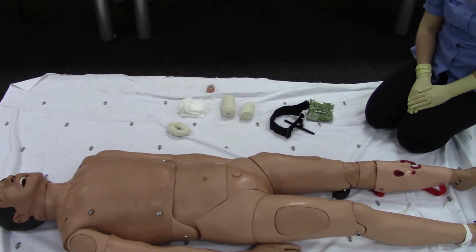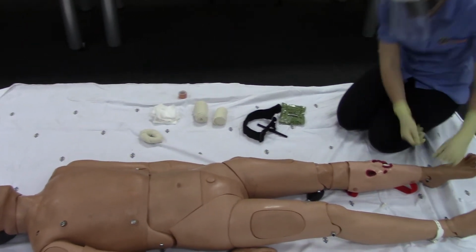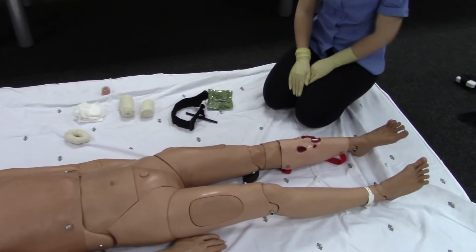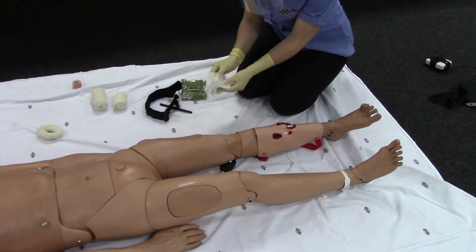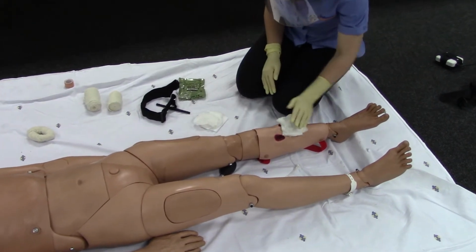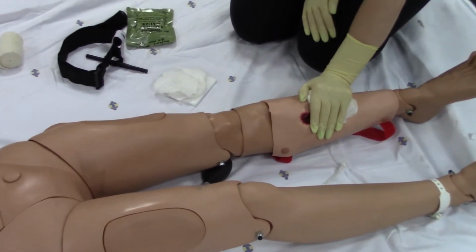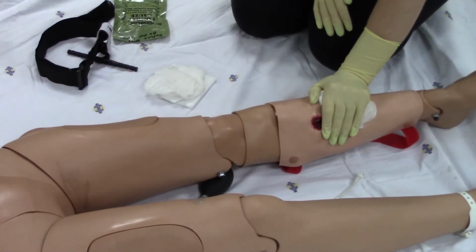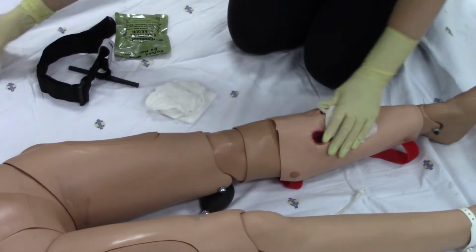Step 3. Bleeding control with the dressing. Expose the bleeding site. Apply direct pressure over the wound with a dry, clean dressing. Keep pressure on the wound until bleeding stops. Apply a bandage to take over pressure on the dressing.